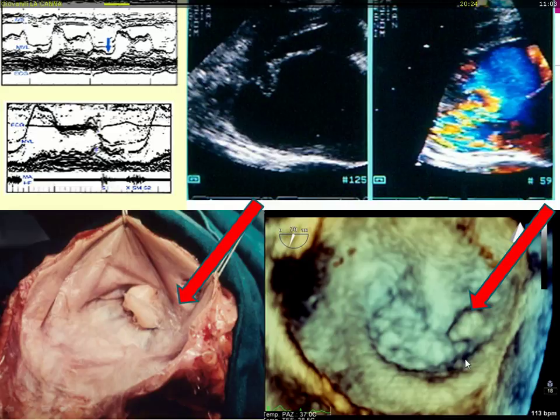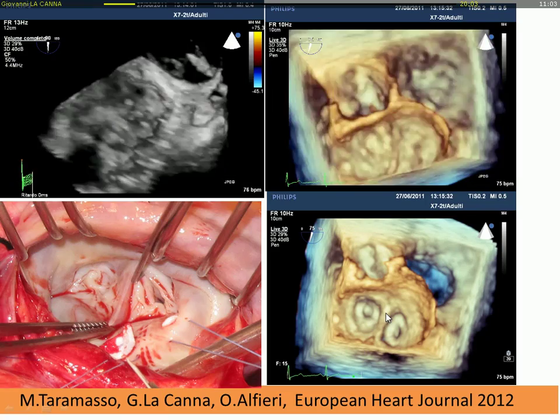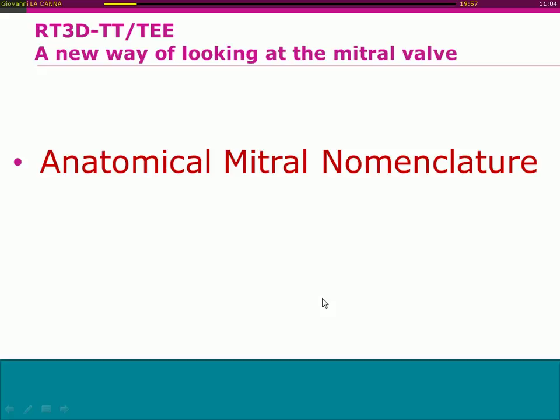This is an example of imaging of a posterior medial commissure prolapse with clear overlap with surgical findings. This is another example of an unusual double mitral valve with stenosis. As you can see, this imaging reproduces very clear anatomical findings.